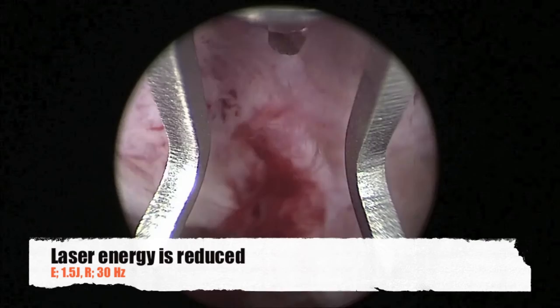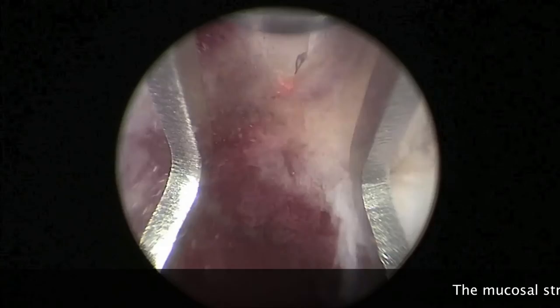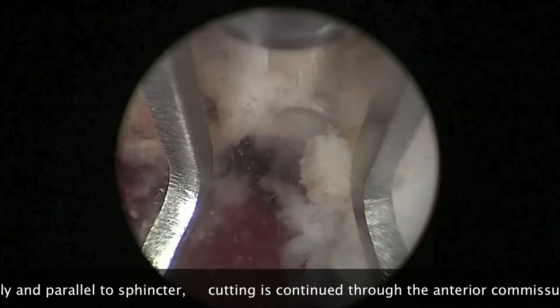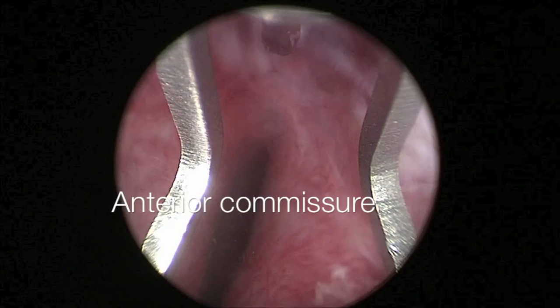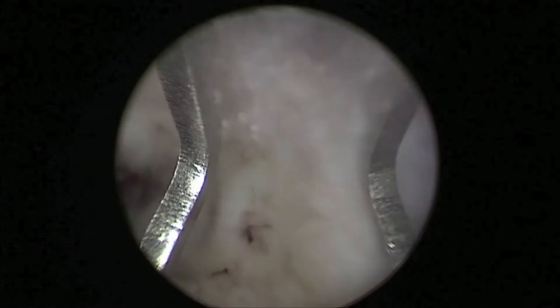For cutting of the mucosal strip, the laser energy is reduced and we start cutting transversely and parallel to the sphincter fibers. Our direction of cutting is directed towards the anterior commissure, which is the anterior attachment between the two adenomas. Any remaining attachment of the adenoma to the contralateral lobe is completely cut through cutting the anterior commissure, and finally the adenoma is completely detached and pushed to the bladder for morcellation.